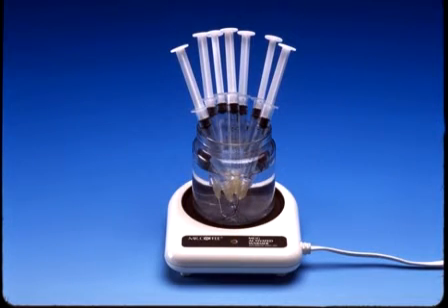Warming sodium hypochlorite to approximately 60 degrees centigrade or 140 degrees Fahrenheit significantly increases the rate and effectiveness of tissue digestion. Clinically, a 60 degrees centigrade warm water bath is achieved by placing a beaker of water on a hot coffee plate. Preloaded syringes of sodium hypochlorite may be warmed by placing them in this water bath.